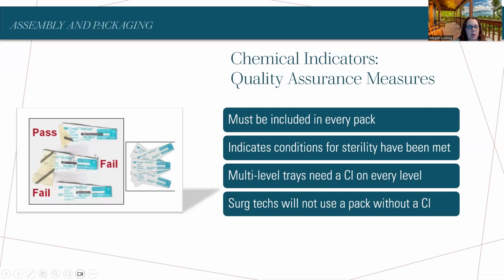And your surgical tech, as they open this, is going to be checking these. They're going to check to A, make sure they're present, and B, they're going to check this gauge. It may not look exactly like this, but this is a good example. Even this tape right here, as it's turned black, shows that it went through the process. It's an indicator tape. So if the black is in this reject section, even just barely, I would question this one. Yeah, it's a fail. Even if it were right on the line, I'd probably still question it. And when in doubt, we throw it out.